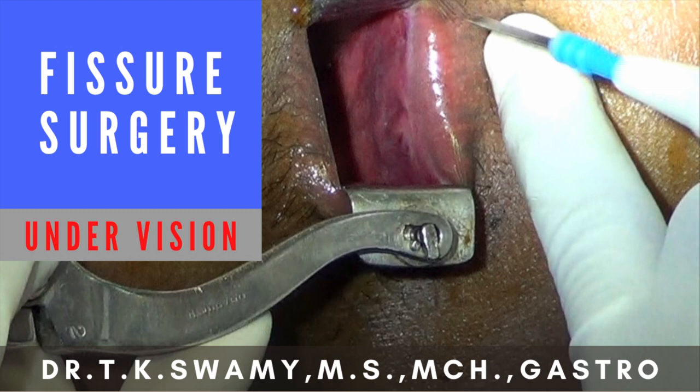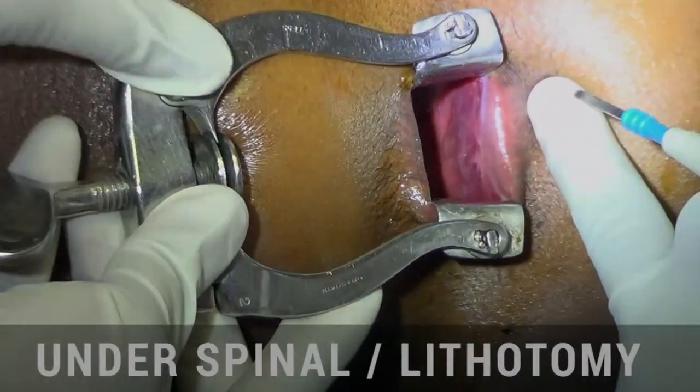Hi friends. In this video, I will show you our technique of doing internal sphincterotomy for chronic fissure in anum. We do it under vision. We don't do it blindly.